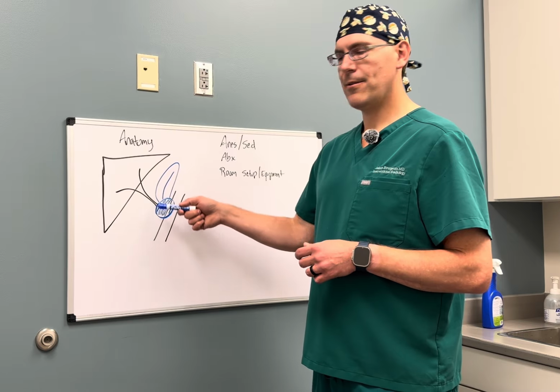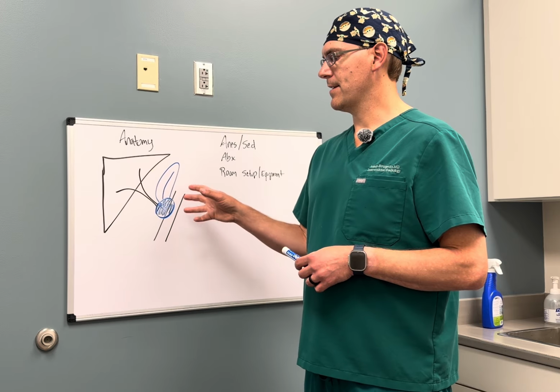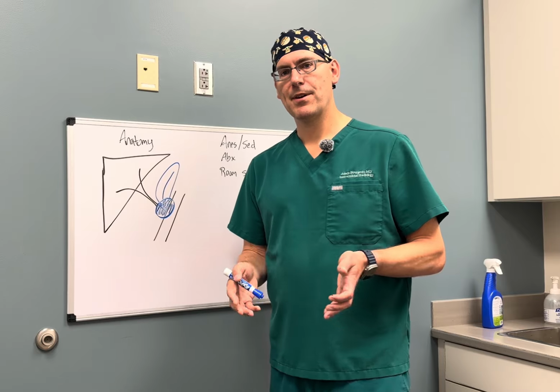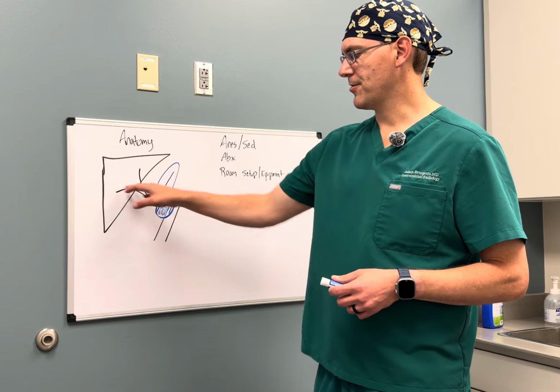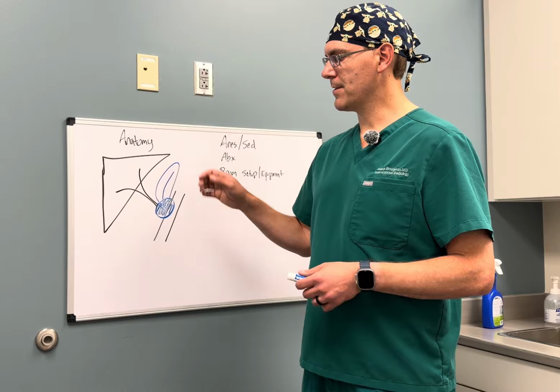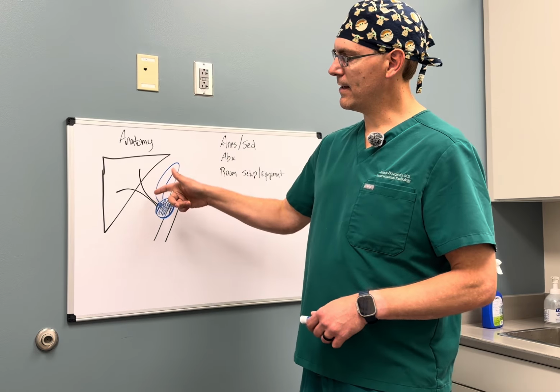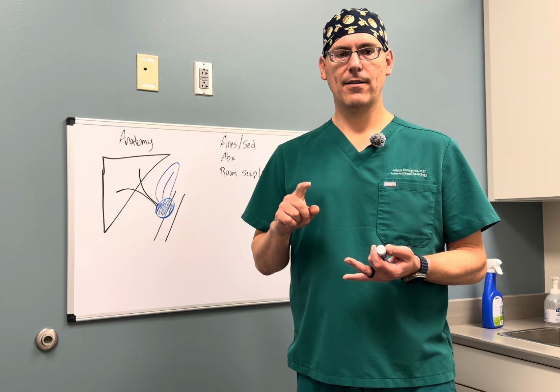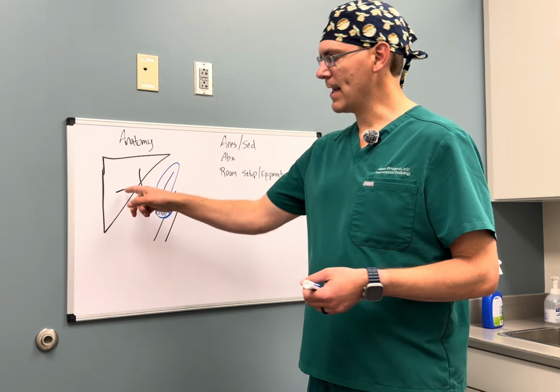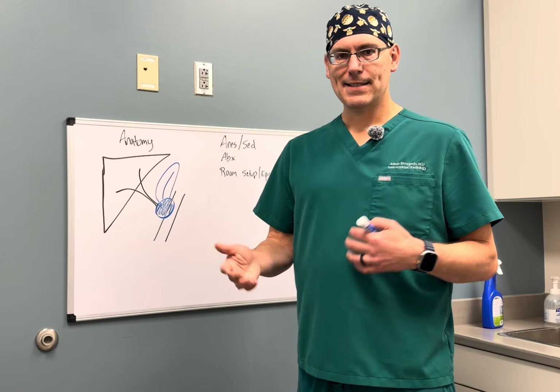Many of these come as a failed ERCP, and we know there's a mass there. In these situations, we try to do really all of these three things at once. We put the patient to sleep under general anesthesia, and we attempt to place a drain. There's some debate right now as to whether you should do this through a right-sided or left-sided drain access. The left-sided ducts have less pain, they tend to have fewer maintenance problems, and they tend to work a little better on average than the right-sided drains. But the angle from the right-sided drains to place a stent tends to be a little better.